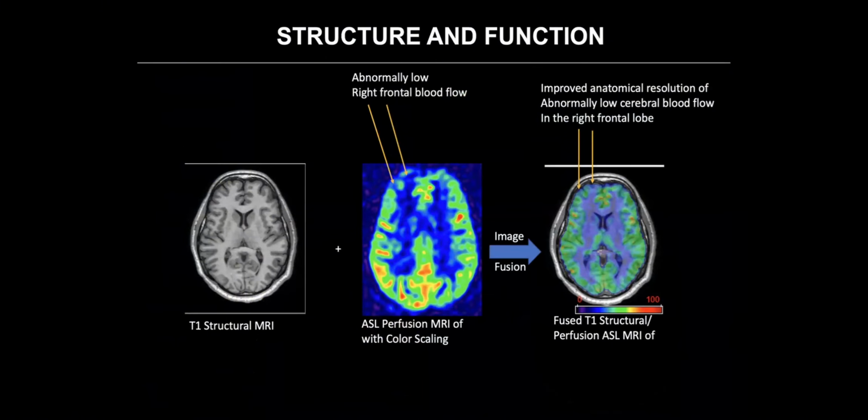Well, sometimes we can even fuse form and function to get overlays of the brain. You can see a structural MRI in an individual. You can see an ASL perfusion map with color scaling. You can actually merge these two scans together to see the exact anatomy of the abnormally low blood flow in the brain. We can see, both grossly and with greater anatomical precision, that there is reduced blood flow, in this case, in the right frontal lobe. And again, this is radiological assessment, so it's a paired opposite compared to what you see in the conventional reading.